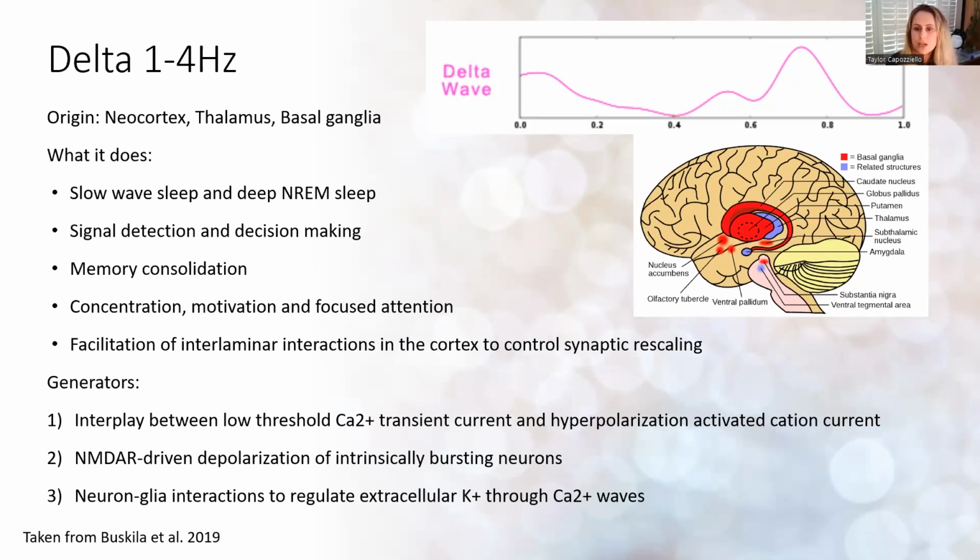There are two general patterns of the EEG seen: cortically generated delta, which is a disconnection of the cortex from the thalamus and results in increased delta. That's what we'll oftentimes see in our practice.